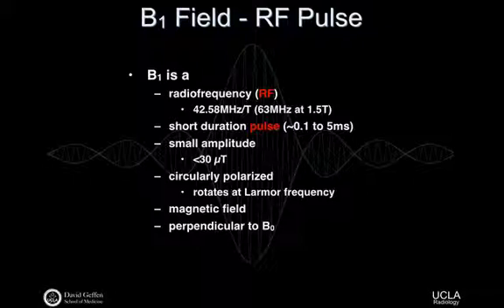So these pulses are going to be less than 30 microtesla. In fact, a lot of systems can't even generate a 30 microtesla field with their B1 coil. There are 5 microtesla fields or 10 microtesla fields. Maybe 20 is going to be used with some frequency. So I want you to appreciate these values because they're so completely different. We're engineers or physicists or chemists coming from different backgrounds, but we want to appreciate the orders of magnitude difference of this B1 field compared to the B0 field.